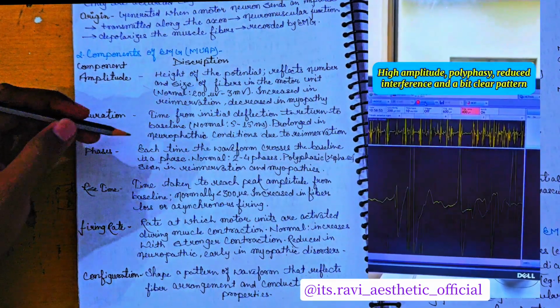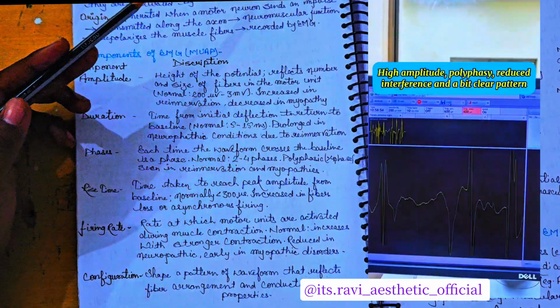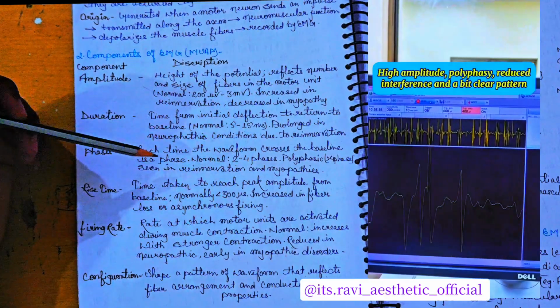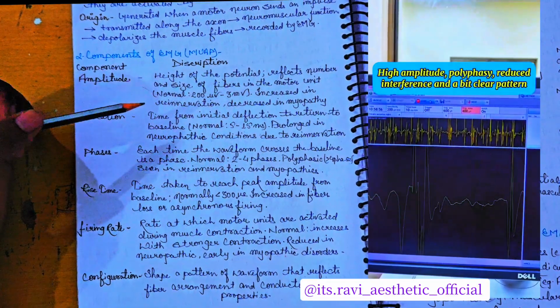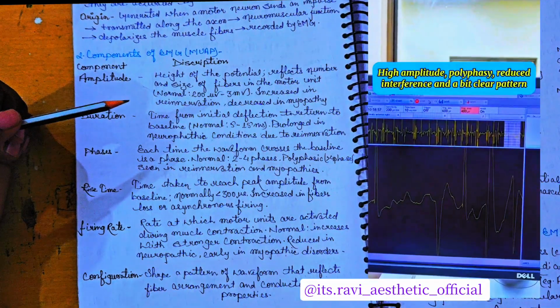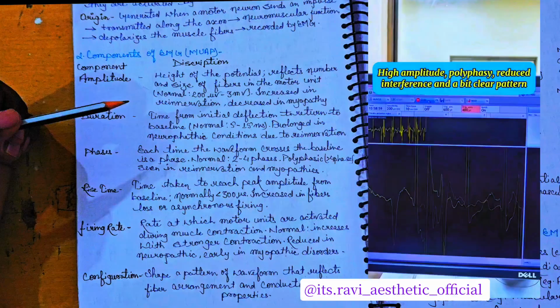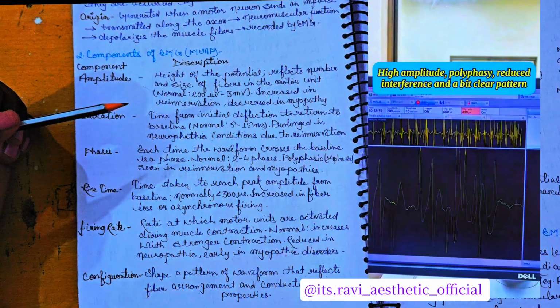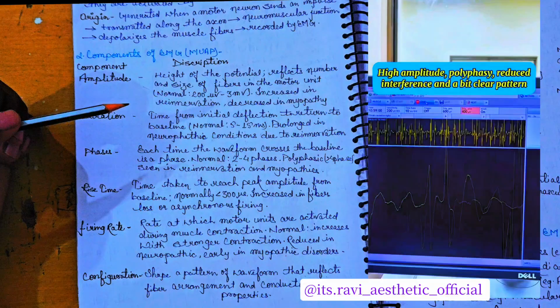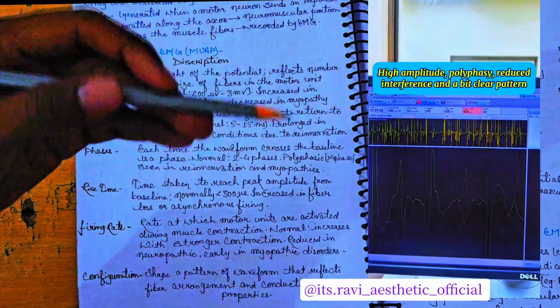So what are the phases? Each time the waveform crosses the baseline is a phase. Normal is 2 to 4 phases; more than 4 phases is polyphasic, seen in reinnervation and myopathies. We studied the phases in the previous lecture. Different phases have different waveforms shown on the screen of the electromyography. They cross the baseline and show the waveform in different muscles of the body.